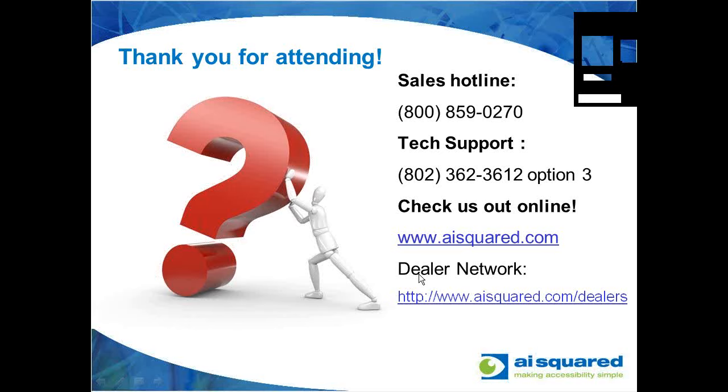ZoomText camera utilizes an off-the-shelf or a consumer webcam to view and magnify printed material. It won't be able to OCR that information just because the quality of the camera lens just isn't good enough. Image Reader will come with a specific document camera that is officially suited for taking pictures of printed material. It's set up in a way that the camera arm will be able to take a picture of an 8.5 by 11 sheet of paper or an 11 by 14 sheet of paper as well. So that product is a little bit different. It's not going to be able to do the magnification like the ZoomText camera. So that is specifically for OCR. We'll have more information on that in the coming months, hopefully sooner than later.